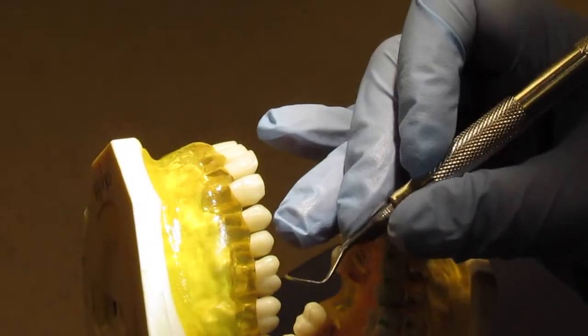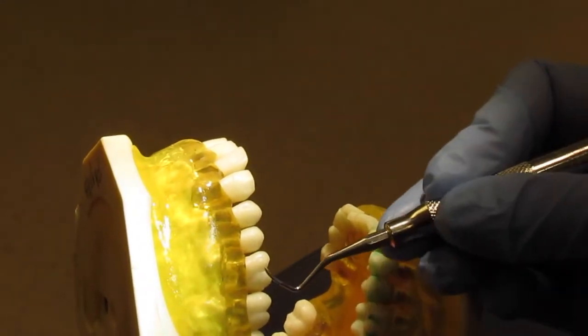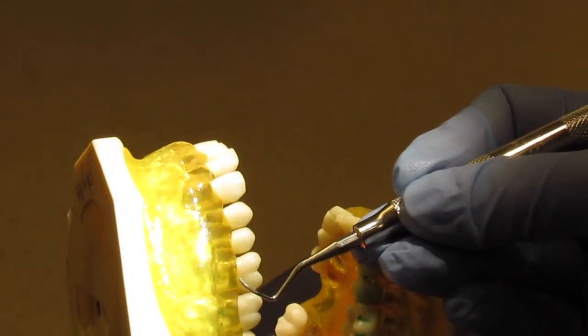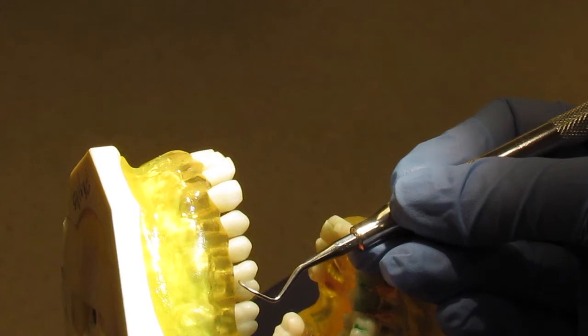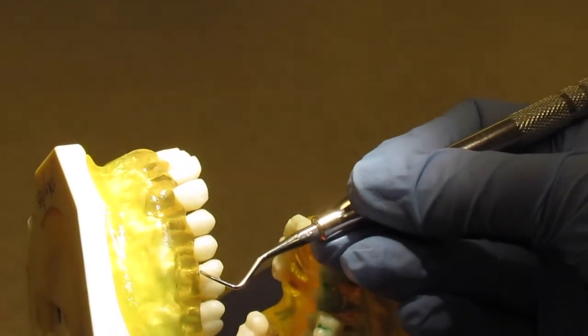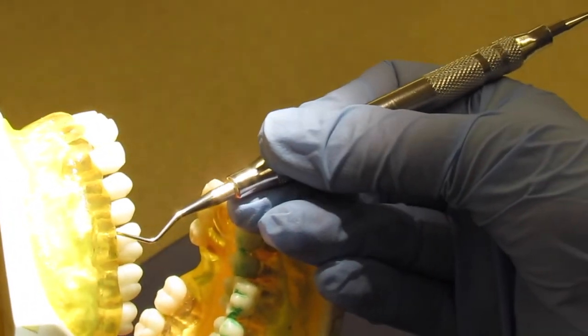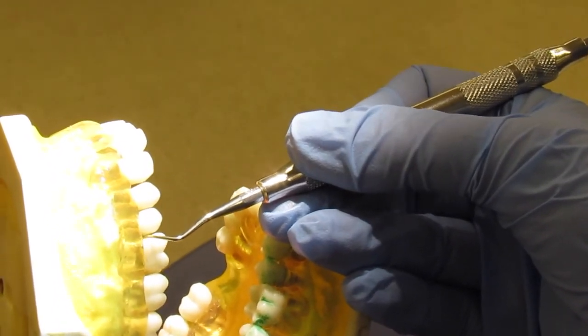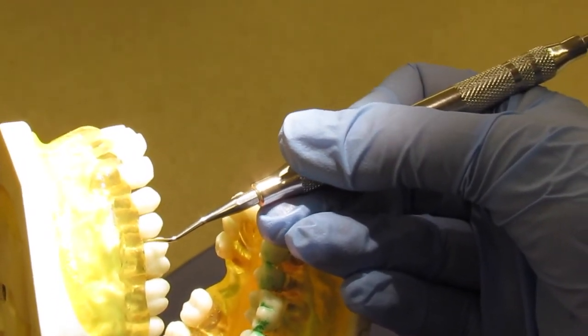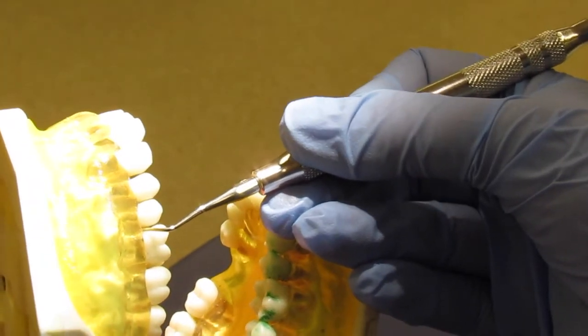Take it out, turn it so it's facing toward the mesial, establish an extraoral fulcrum. At this point you're going to be using a little pull stroke. So each stroke you're pulling and turning, pulling and turning, and go all the way to the mesial area.